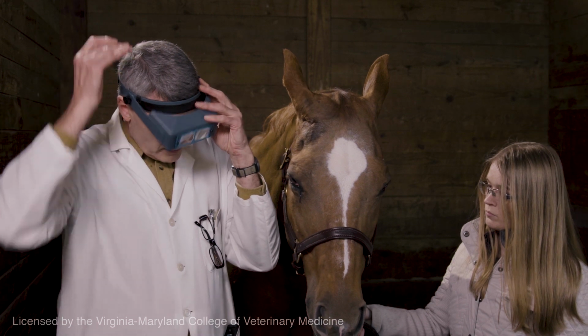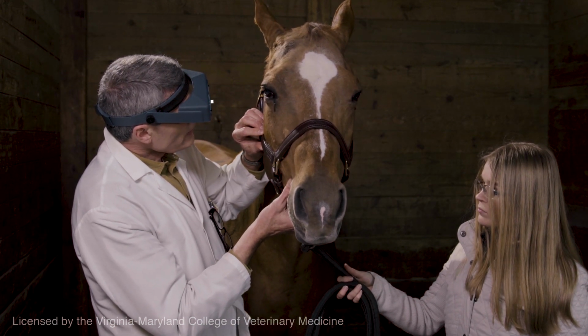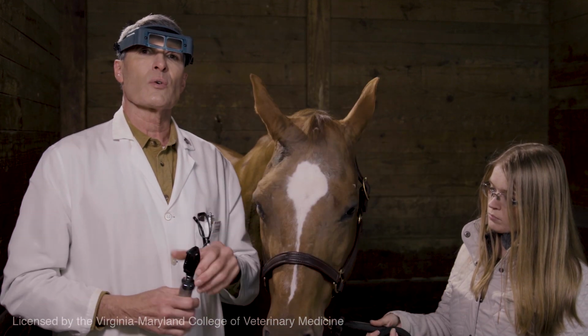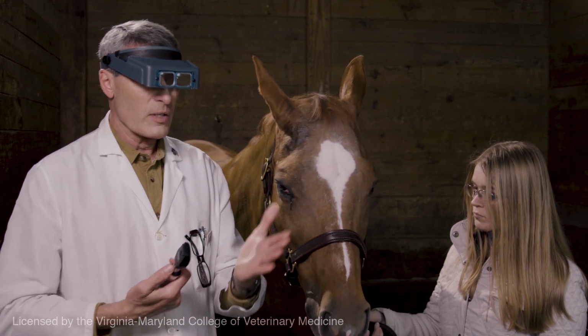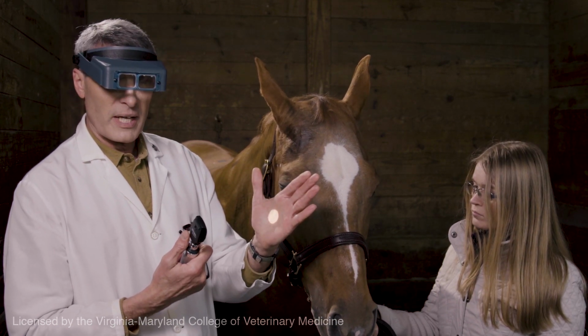So when I put this on, I can get even closer still and be able to see things in focus, and the close proximity allows me to have bigger magnification. So the next thing we're going to need is a light source, and you can use your direct ophthalmoscope and just basically use a large spot of light.